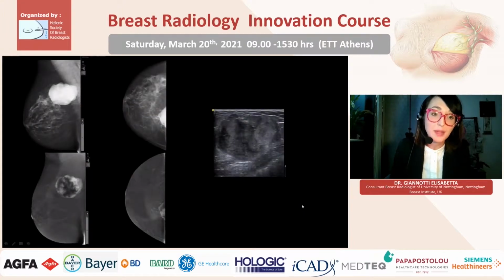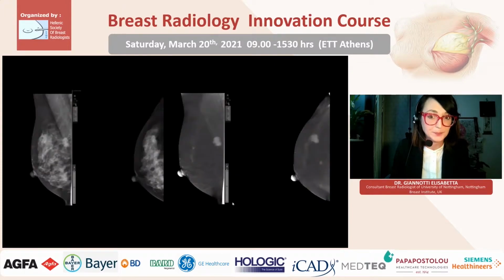This was another patient, came symptomatic for a large mass in the upper center right breast, and we can see these rim enhancements were quite irregular, and of course I think we all agree to the fact that these look suspicious, and this is the typical appearance of mucinous cancer. So they give a rim enhancement, but usually the rim enhancement is more irregular than the standard cyst.